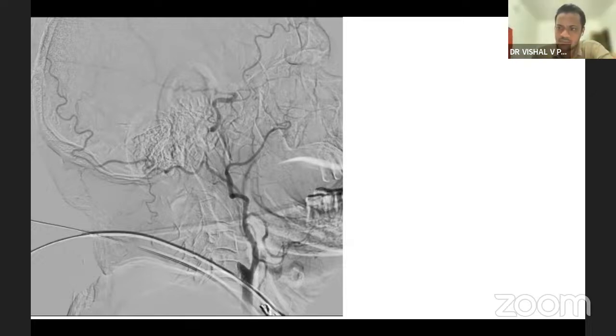Pseudoaneurysm formation. Pseudoaneurysm is unlikely. If you dissect it, is it a problem? Already it is completely occluded. Exactly. Not only occluded, already it is chronically stenosed. So always think like that. If this is going to be a dissection, if there is going to be a problem over there, carotid rupture, pseudoaneurysms coming in, that's all we can take lately.